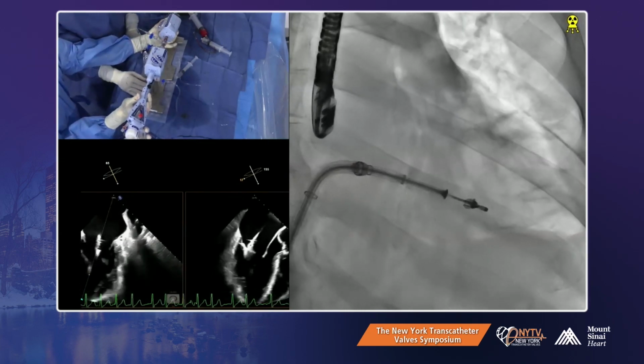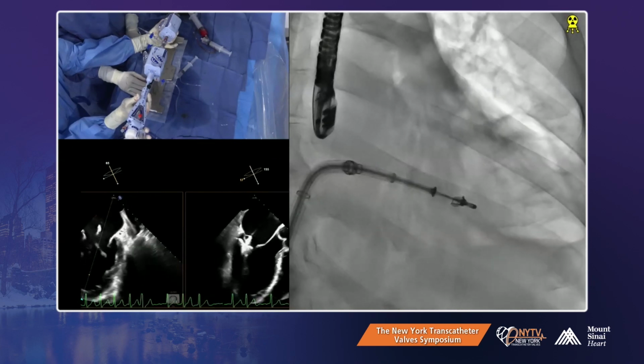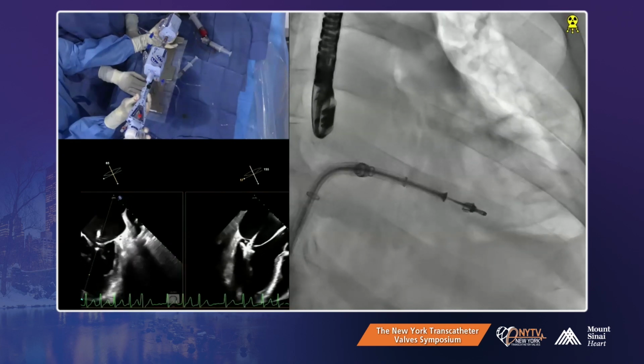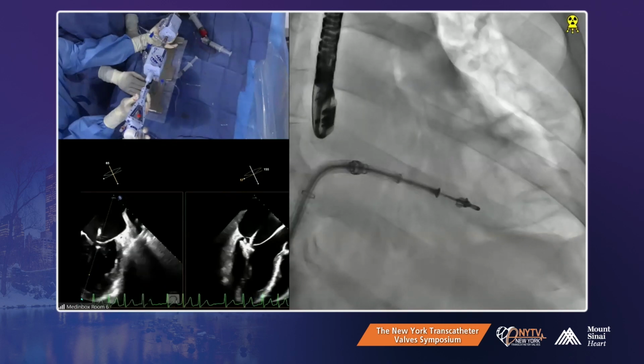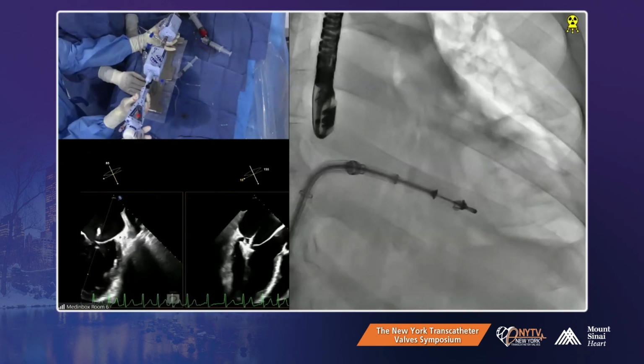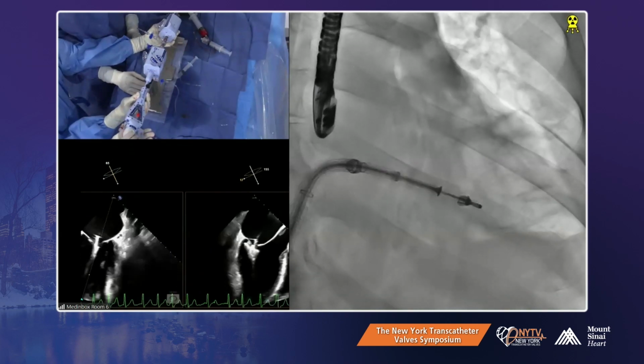It's not curling anymore. Looks like it's laying flat on the arms. What are you guys saying of the posterior now? I think esmolol should work. Everybody feels esmolol. Okay, yeah, go up on the esmolol. I'm sure you can slow the heart rate. You've got a very good posterior insertion. So counterclockwise is pretty good. Yeah, anterior, you got the posterior now.